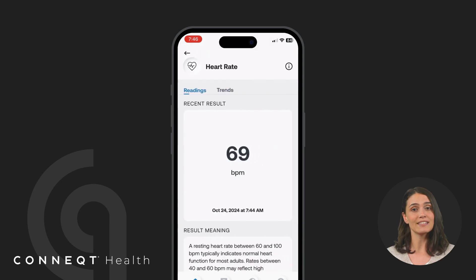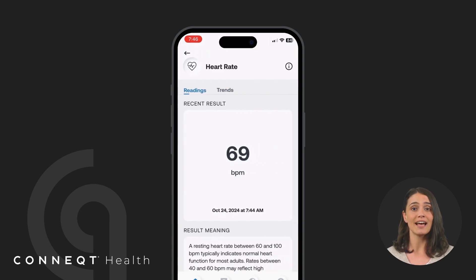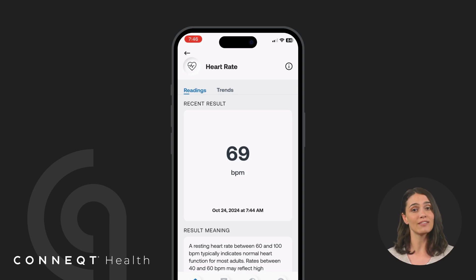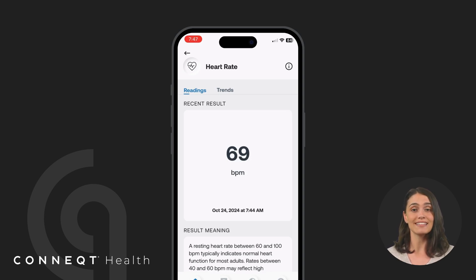Heart rate is the number of heartbeats per minute, reflecting your heart's activity and efficiency. It is measured beat to beat, providing precise and detailed insights into how well your cardiovascular system is functioning and adapting to your body's needs in real time, similar to monitoring in a hospital setting.